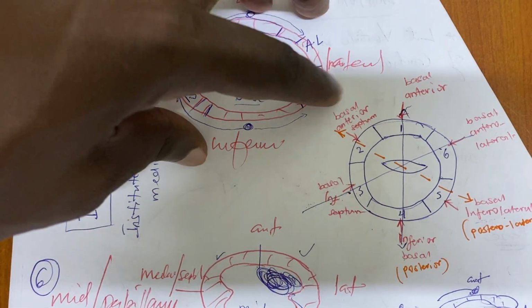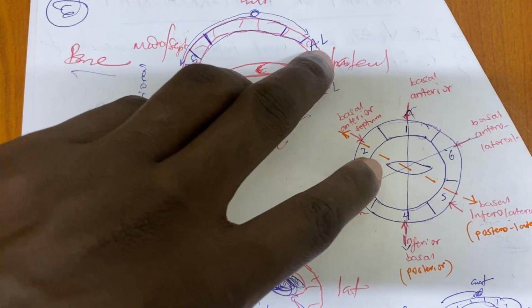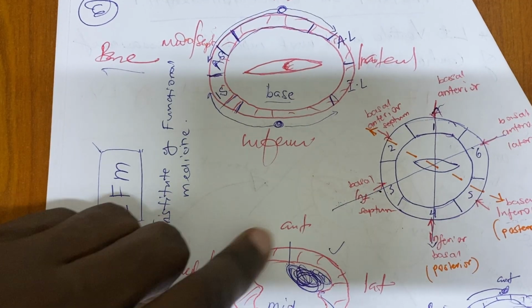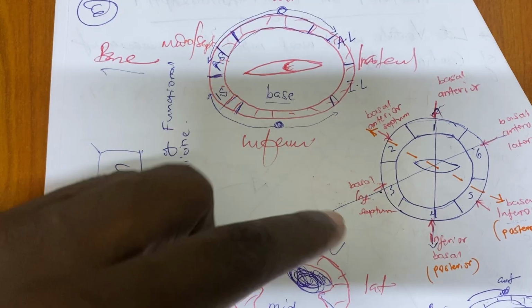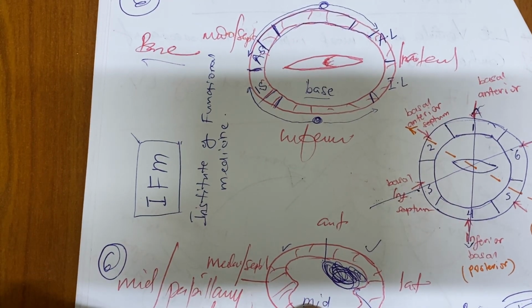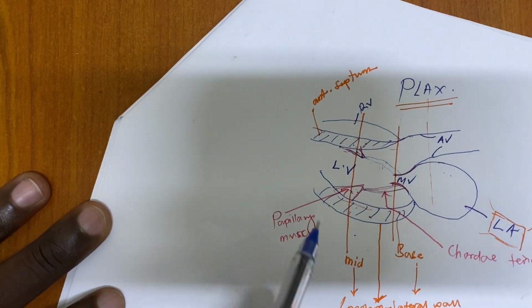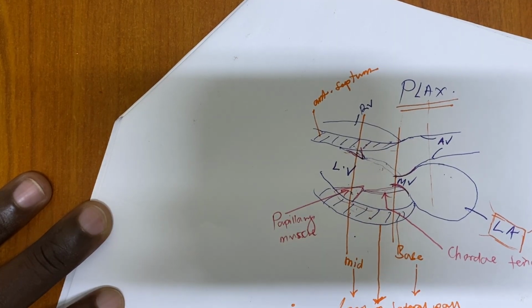So when I take here short axis, I see how it is contracting. I go to mid, I see how it is contracting circumferentially. This is showing circumference, so you can see at different points here, here, here, here, and compare. And then I go to the apex and compare the contractility. And then from there, I go and then take this one now. This one I've already taken from the start and I've assessed how it is moving.